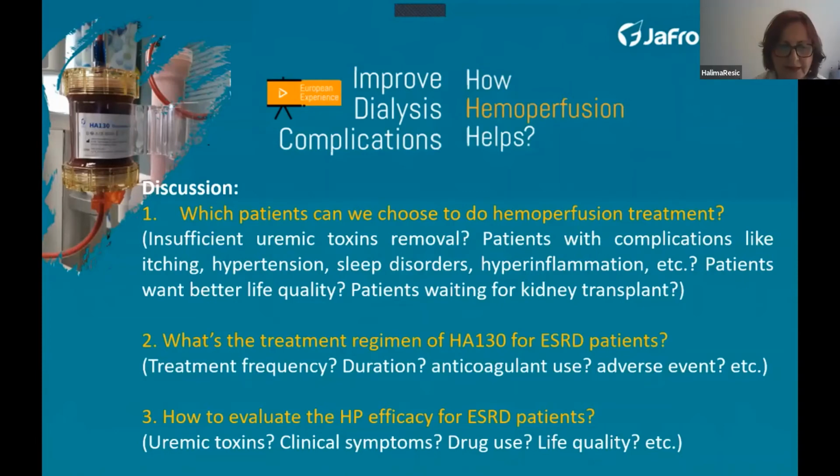Yeah, I think that this presentation for our doctors presents the same thing, that the main indication is that we can always fight in dialysis with our patients about renal osteodystrophy, itching, and so on. I think that is a problem for nephrologists, especially in newly developed countries, in Bosnia and Herzegovina, where we have no transplantation.